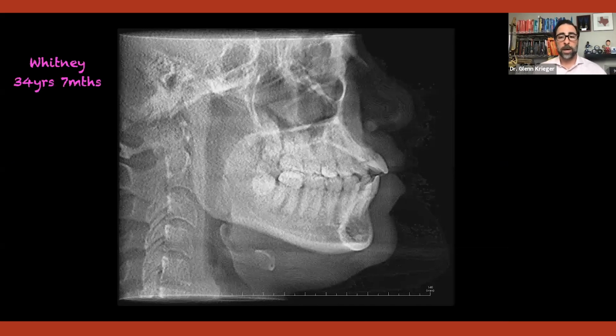So let's go on to Whitney. Whitney's 34 and a half, give or take. She has that excessively proclined and protruded upper central incisor. So lowers are also a bit proclined, a bit protruded. She is a tongue thruster. She comes in knowing that. She's been a speech pathologist. We know there's an issue there. And again, here's her lateral ceph.